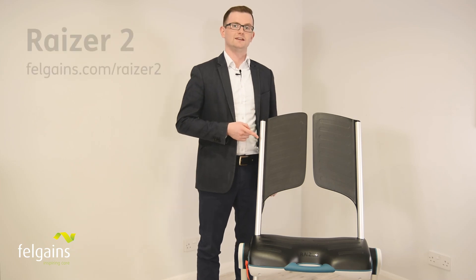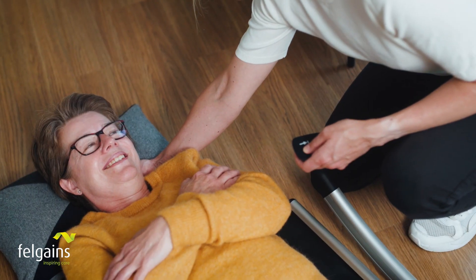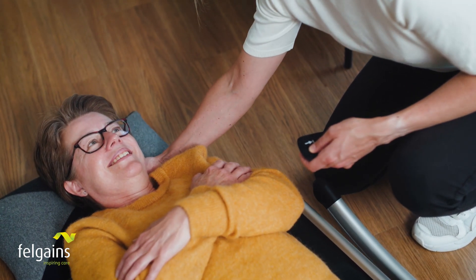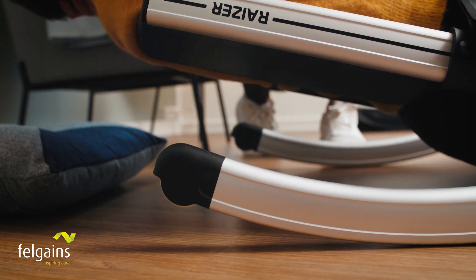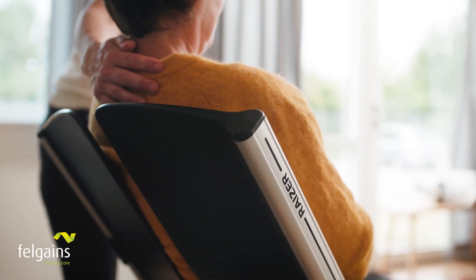This is the Raizer 2, the flagship lifting chair model. Faster, easier and more stable than traditional lifting cushions. The Raizer 2 is an ideal solution for transferring somebody who has fallen to a sitting or semi-standing position.